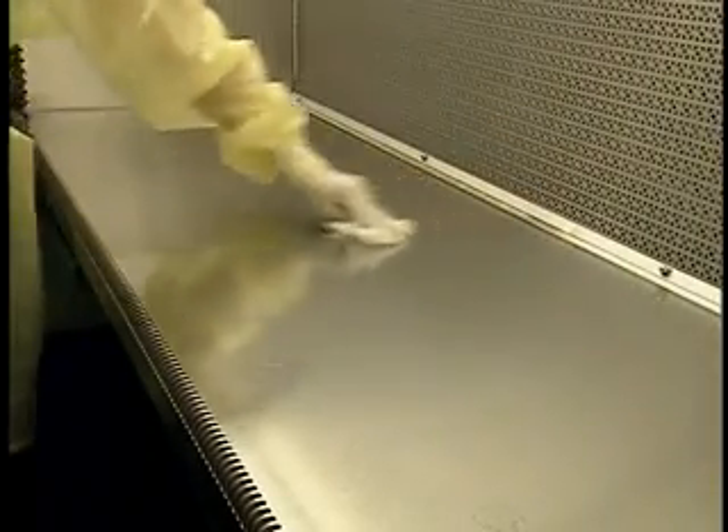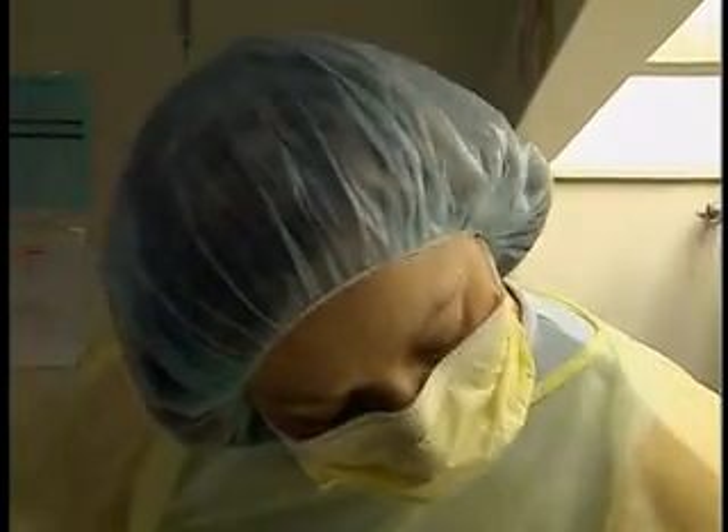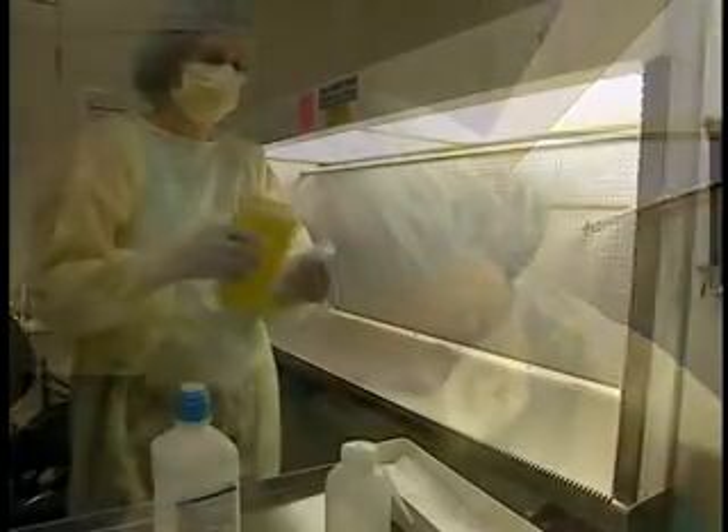Note that laminar airflow hoods, whether horizontal or vertical, must be disinfected twice a day — that is, at the beginning of a work period and at the end of it. The hoods are cleaned with water, however, only once a day, just before disinfection.